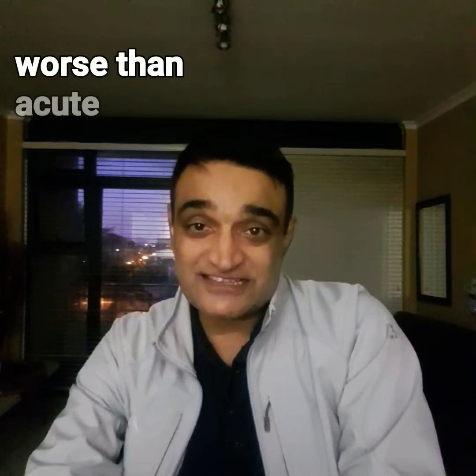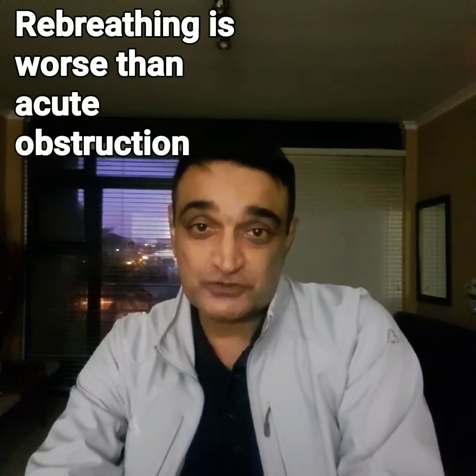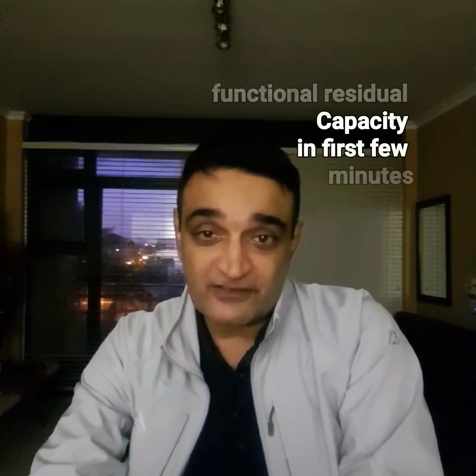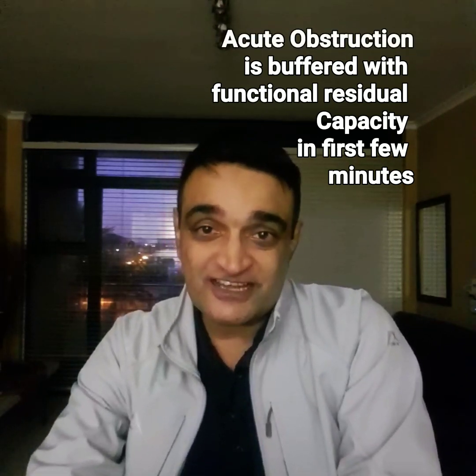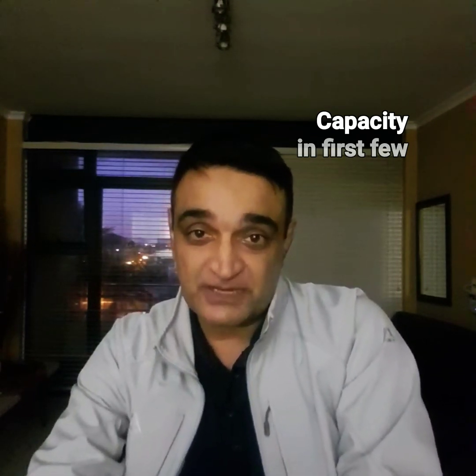It's even worse than acute obstruction that occurs with a kinked endotracheal tube, because with the kinked endotracheal tube and acute obstruction, there's some reserve in the lungs in the form of FRC, or functional residual capacity, where oxygen is still available to maintain oxygenation until that obstruction is relieved within that short period of time. So the thing is, with rebreathing, we should do as much as possible to avoid it from happening.